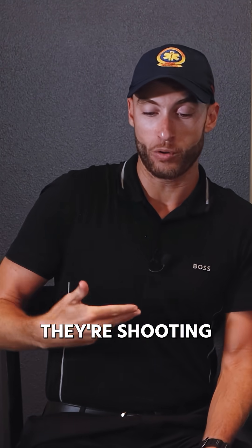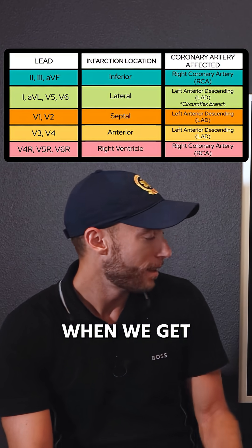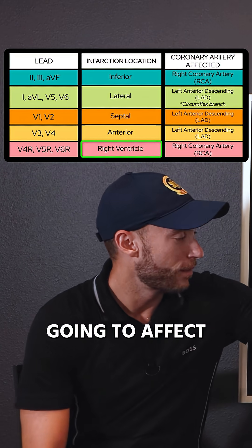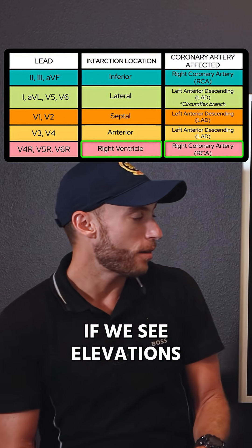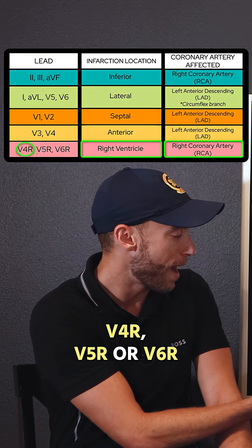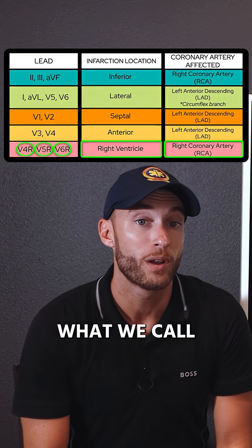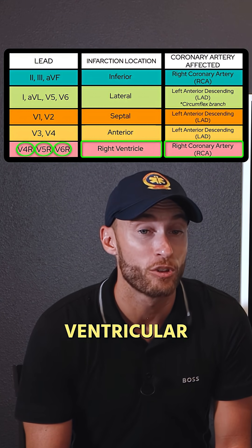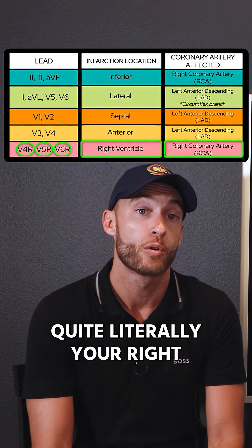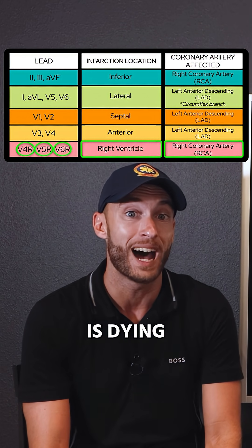With the leads over on the right side, you're shooting the right ventricle — getting a direct picture of it. This affects the right coronary artery. If we see elevations particularly in leads V4, V5, or V6 on the right side, that's very concerning for what we call a right ventricular infarct, which means quite literally the muscle of your right ventricle is dying.